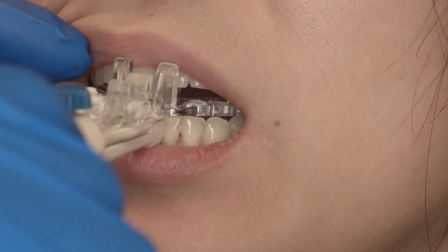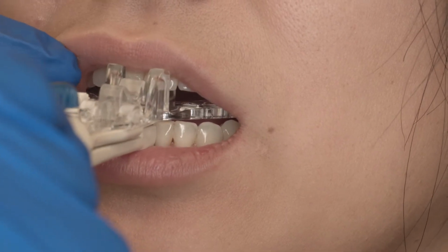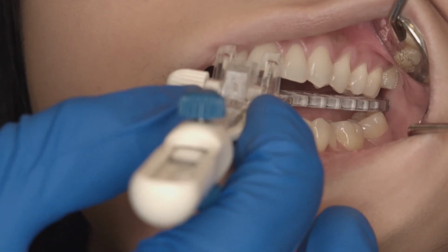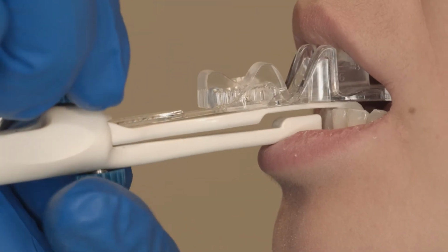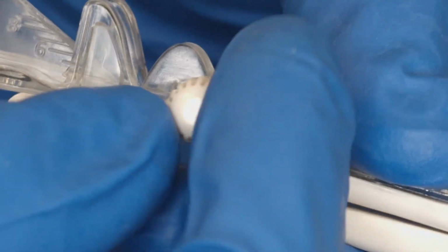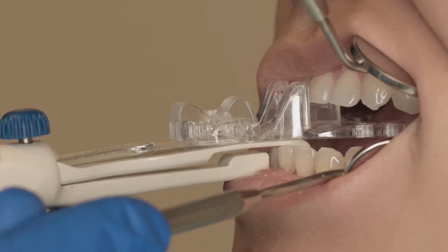Step 3. Instruct the patient to gently close onto the bite fork so that the upper anteriors close completely into the ramp and contact the guides on the fork. Tighten the upper screw to secure the bite fork. Loosen the ramp screw. Move the ramp towards you to contact upper anteriors.